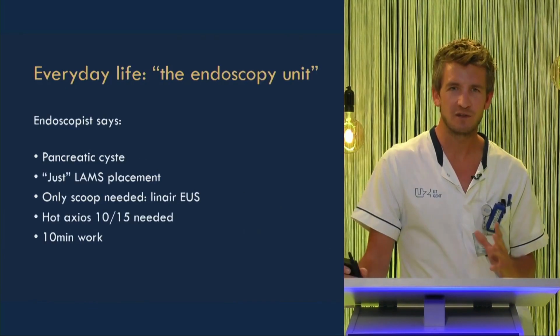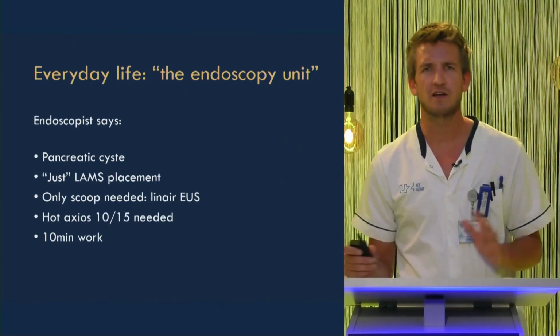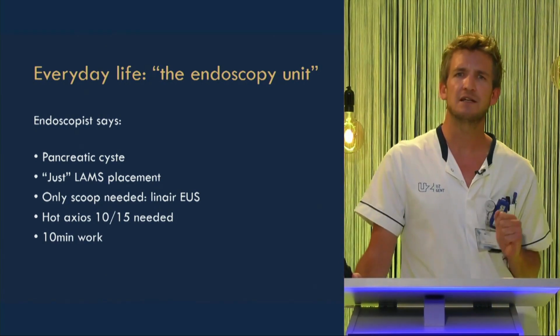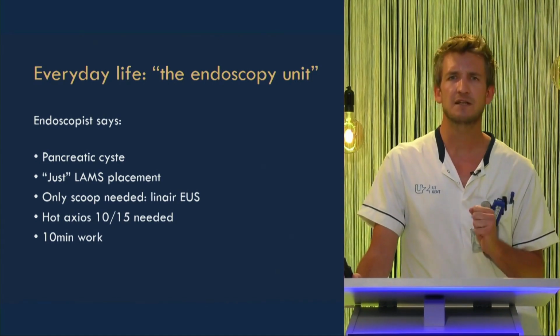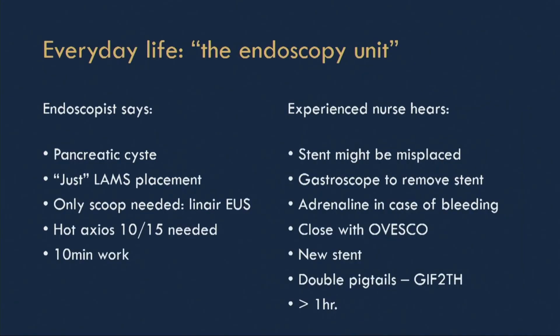To give a little example, when the endoscopist says, okay, we have a pancreatic cyst, we're just going to place a little stent. We're going to use the EUS scope, Hot Axios 10-15 stent. It will take like 10 minutes. The experienced nurse will hear this, and I think I can say I'm an experienced nurse after 10 years.